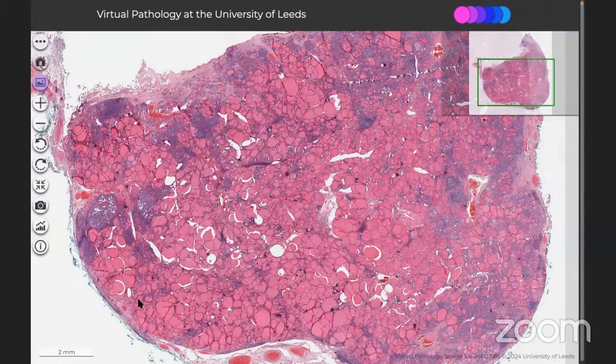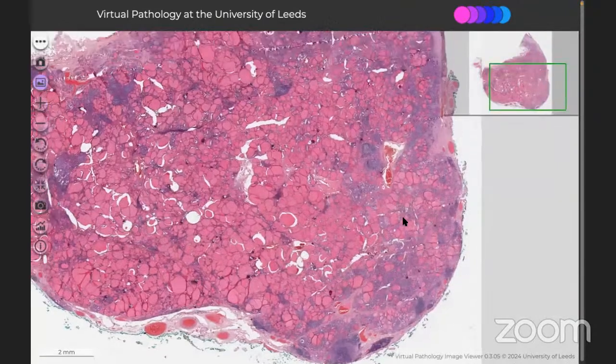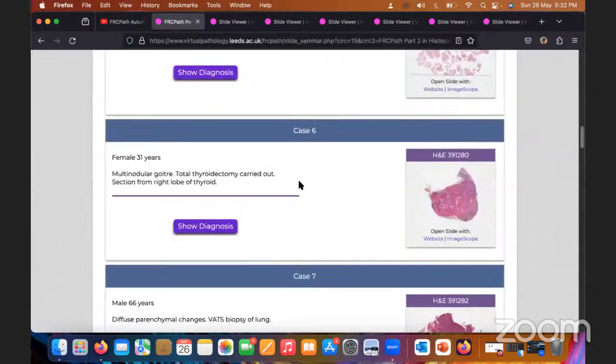And obviously the lesion is well excluded, as we can see the inked margin is devoid of the lesion. So in further workup, you can say that you will discuss this case in the endocrine MDT or head neck MDT, and you will take out any history of previous radiation, particularly whether there was any previous lymphoma or something for which the neck was radiated. So this kind of correlation will be appreciated in the exam. So this was a case of multifocal papillary carcinoma of thyroid.